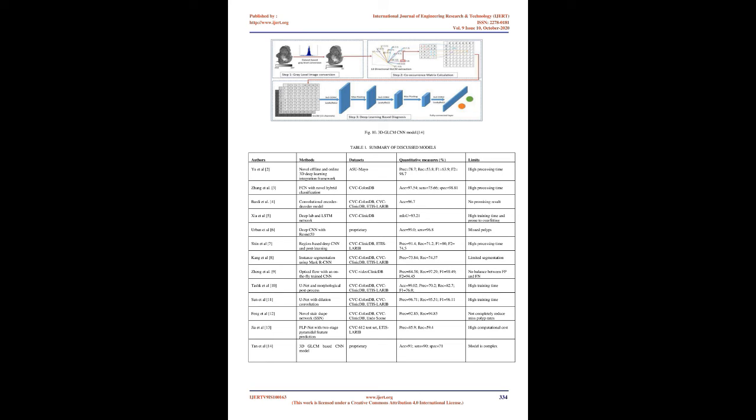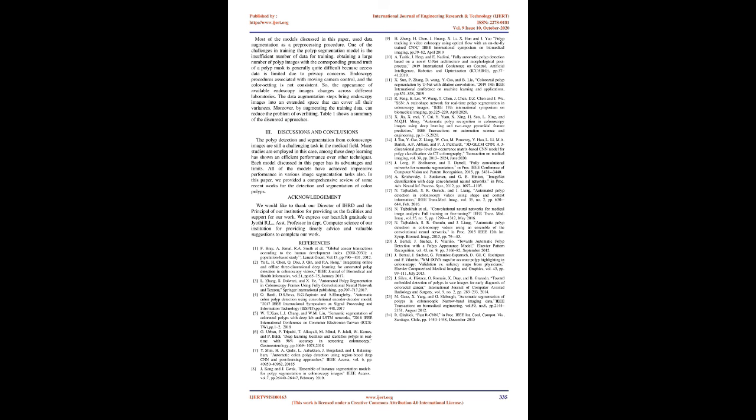Et al. 14 proposed a three-dimensional GLCM-based CNN for 3D polyp classification. This proposed model contains 3 steps. The first step is to convert the original Hounsfield unit CT value of the 3D polyp into a gray level value based on the CT value. Here, a gray level scaling is performed on the original CT image pixel values to an appropriate value range. The second step is to generate multiple three-dimensional gray level co-occurrence matrices.